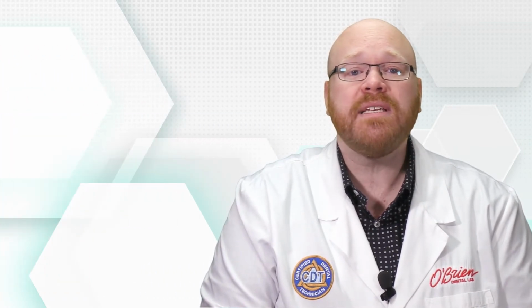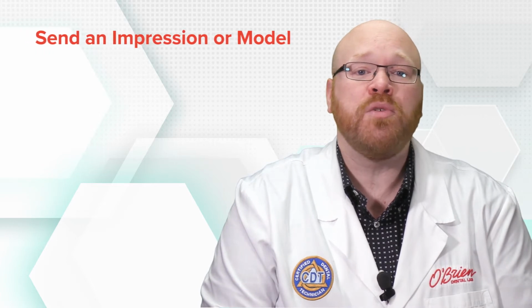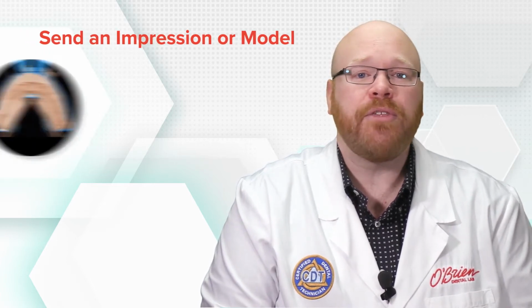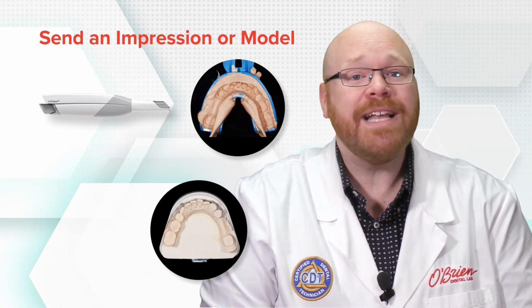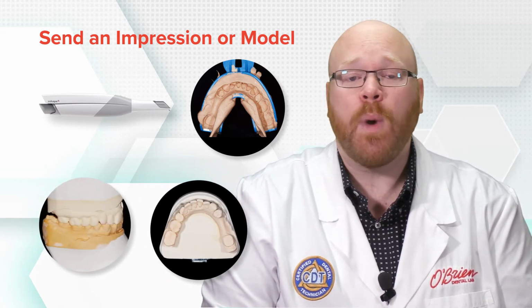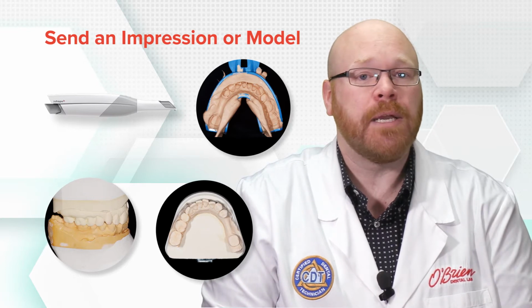The first thing we need to get started is a model of the arch that we'll be doing the planning for. You can send us either a traditional or digital impression or an already poured up model. It's always helpful to have the opposing arch as well, but it's not typically necessary.